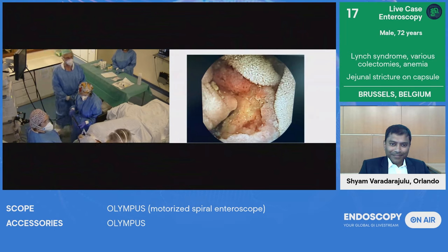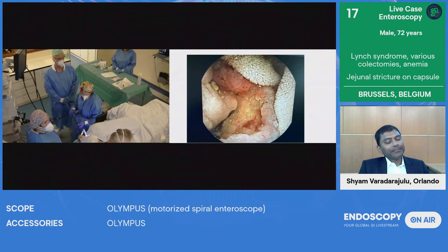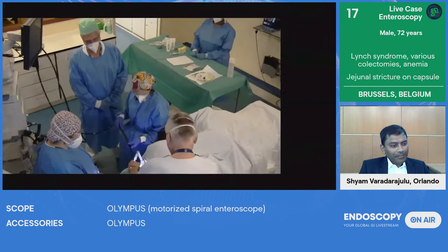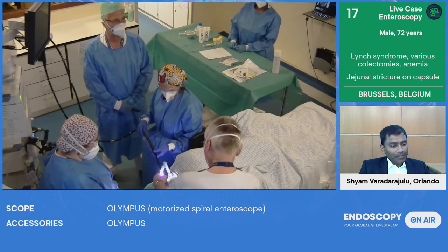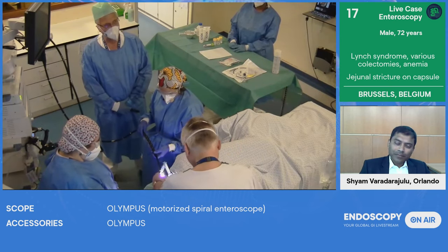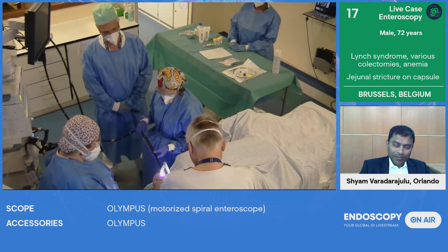And you see that approximately 45 minutes after the pylorus, this lesion was observed at the capsule endoscopy, and the capsule stayed in place for almost 20 or 30 minutes there. So suggesting that not only is there a lesion which is obvious, but also some narrowing. The purpose of this study is, of course, to have a biopsy to make a differential diagnosis between carcinoma, which is probable, or a lymphoma, but also to do a marking of the lesion before possible surgery.